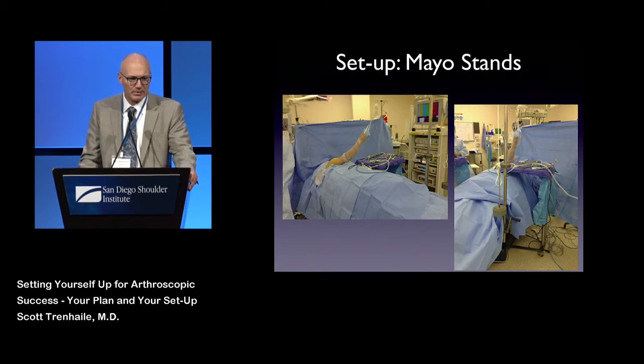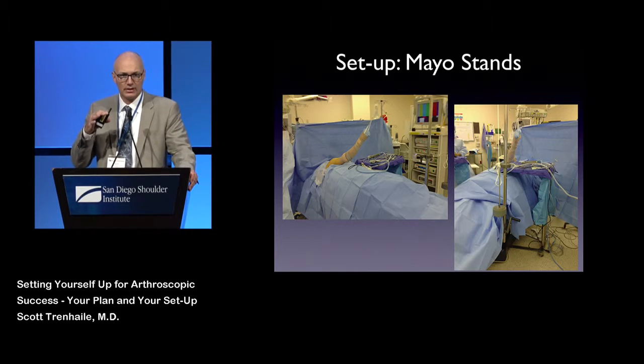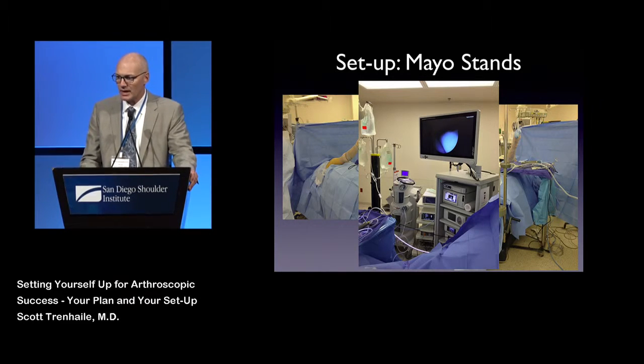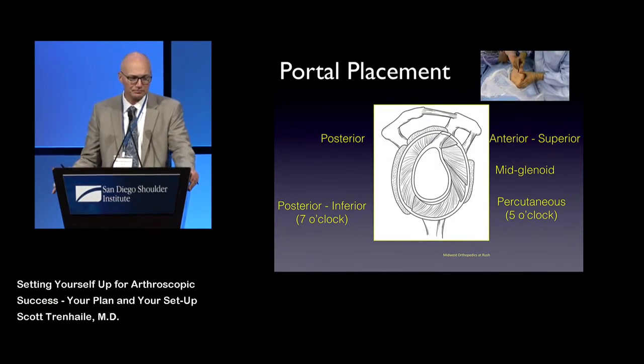And with my setup, I typically use a Mayo stand where I have all of the tubes and wires and things that need to be connected to anything come right off the back of the Mayo stand on the opposite side of the operative field. And on the opposite side, as you look across, I typically try to put the monitor superiorly, and then certainly the water towards the foot of the bed so that the circulators can get to this readily without having to dig into the corner of the room.